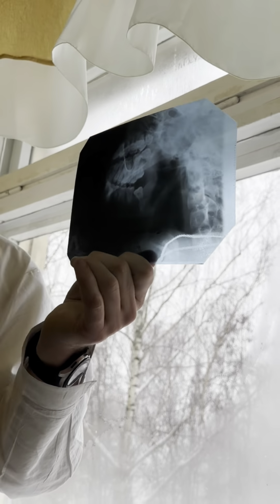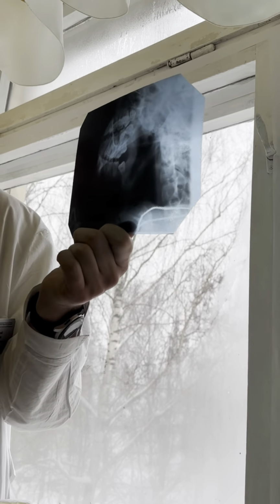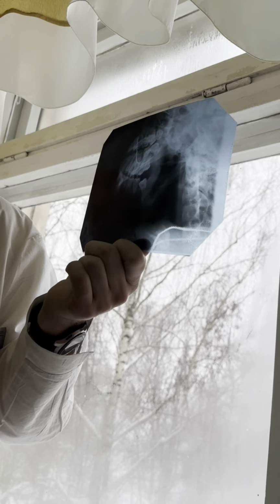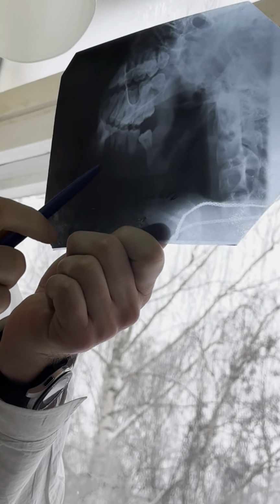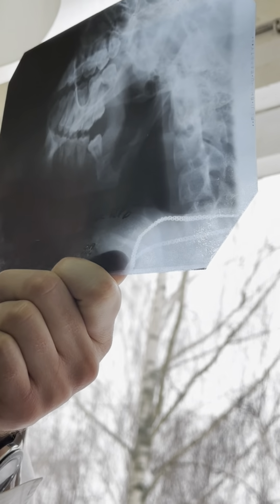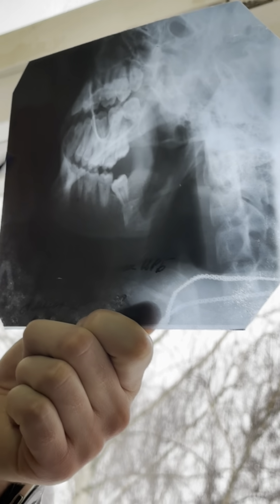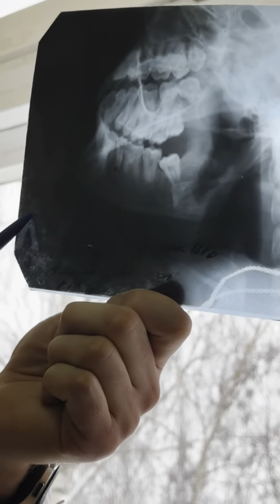If we have clinical symptoms, for example, the patient showed us trauma 1 day ago, and edema, and any other symptoms of the fracture, we can see that in this situation we can give a diagnosis. Traumatic open fracture of the mandible in angulus, left side. Left or right? Left, L, left side.